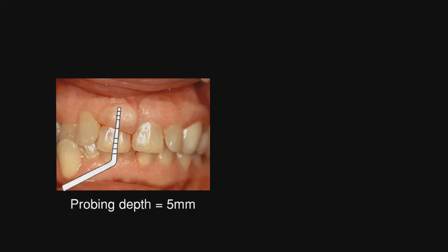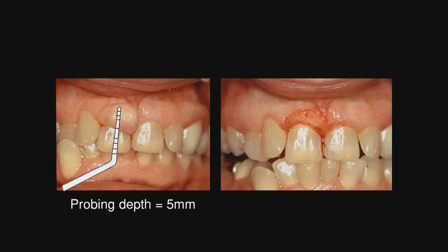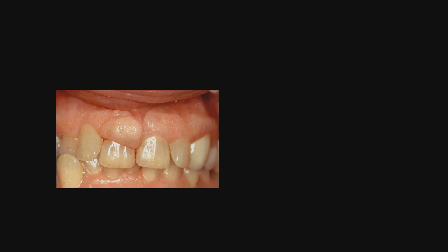And in looking at this, she had a trauma to this area many, many years ago, and almost all of that keratinized tissue is unattached. Yes, it's a thick biotype. So what we did, we went in there and used the radiosurgery to not only remove that, but notice the bevel we placed in an attempt to get a thinner biotype. But we did match it up with the other central incisor, and we now have two central incisors that are 9 millimeters long. And now we have gingival symmetry, which is one of the prerequisites for an aesthetic outcome.